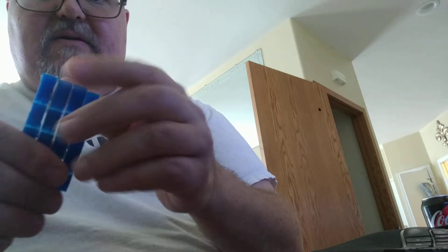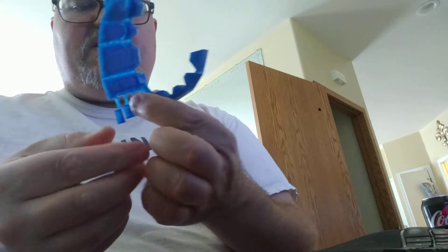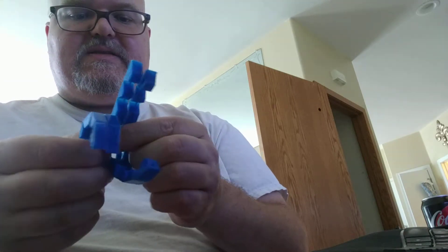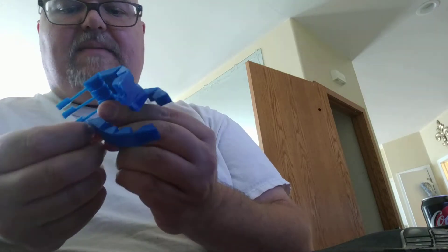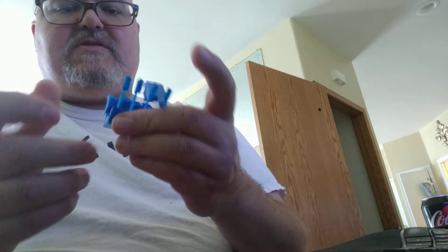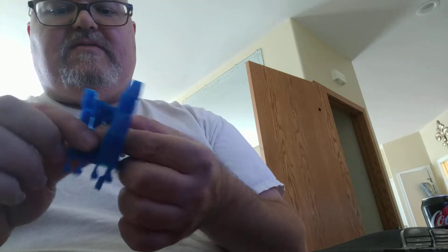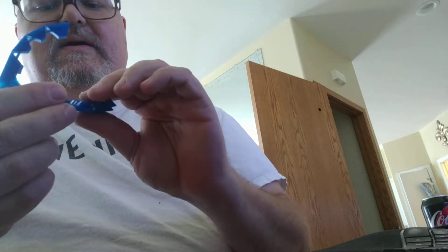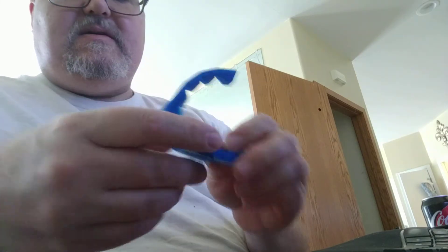All five fingers have one tendon each, which is a massive simplification of our own system. Although when I drive it from servos, I might end up doing two fingers per servo plus a thumb servo, just because otherwise it's going to take a lot of servos and I'd have to make it quite a bit bigger to accommodate all of those. But with 3D printing, that's possible too. Anyway, thanks for checking it out.